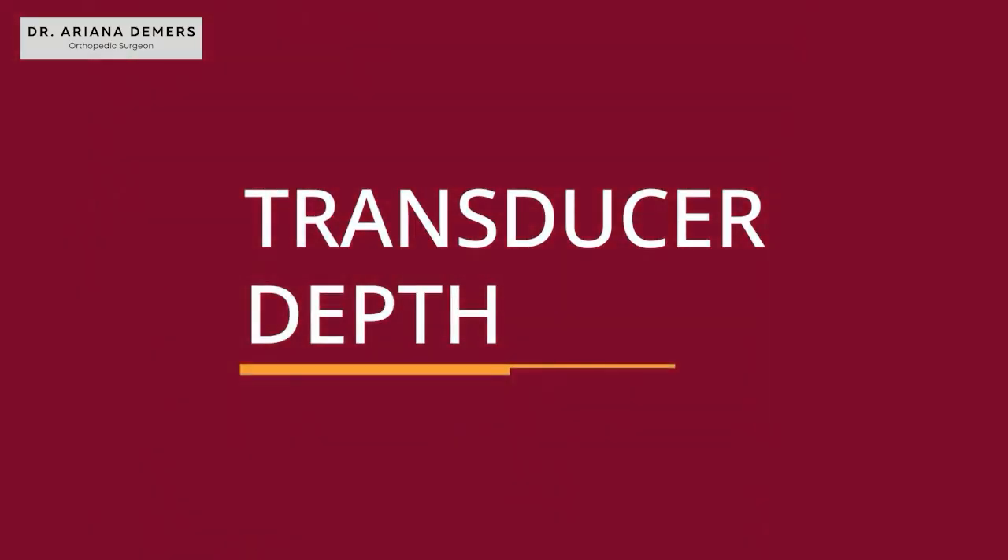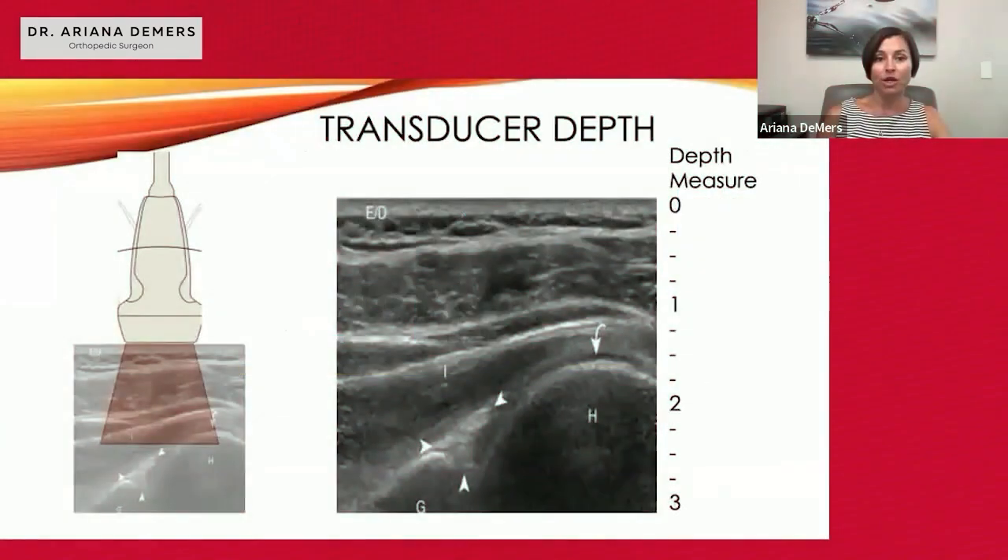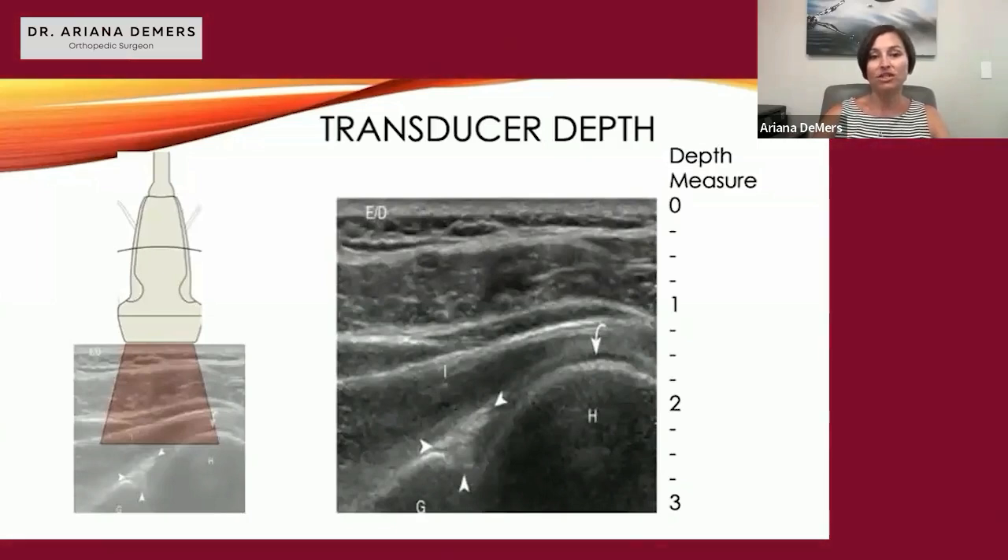On the side of the screen, you're going to be able to see markings showing depth of measurement, and you can adjust the depth with the buttons. This is a picture of the posterior aspect of a shoulder — this is a linear transducer, and the beam is showing directly posterior.